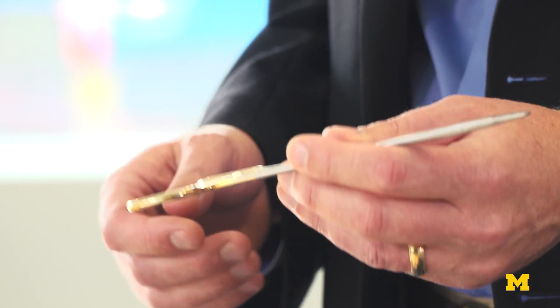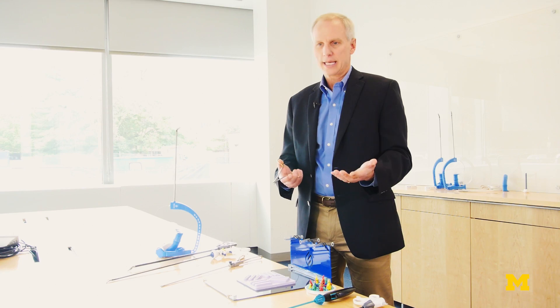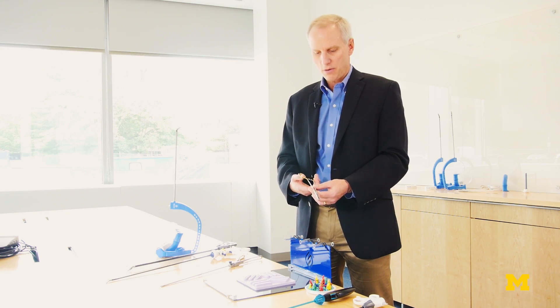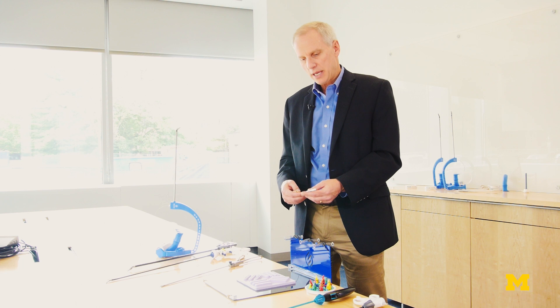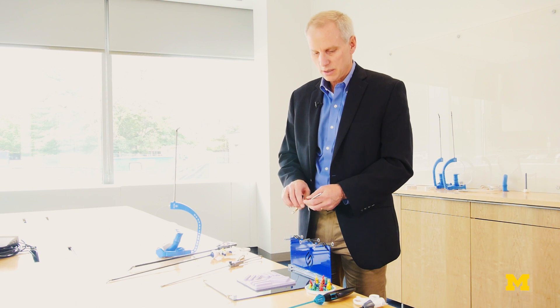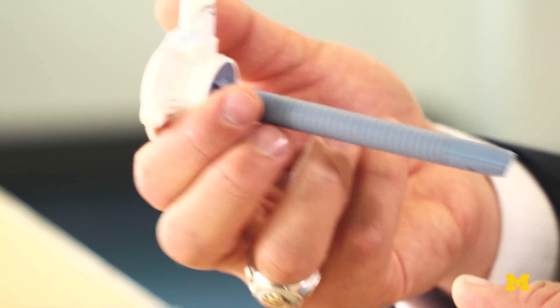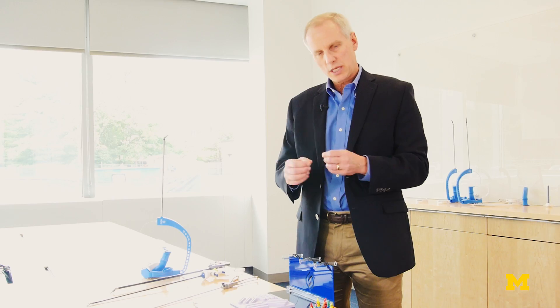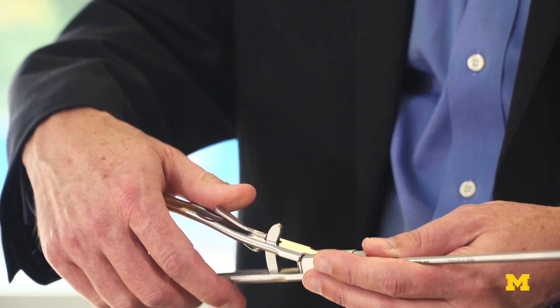When I was trained first in surgery, the only tools we had were tools that looked like this — tools that look like anything out of your toolbox at home — and it required us to make big incisions in patients. A big advance early in my career was the move into minimally invasive surgery, where small ports were placed through patients and small incisions were made, which required the tools to be long.